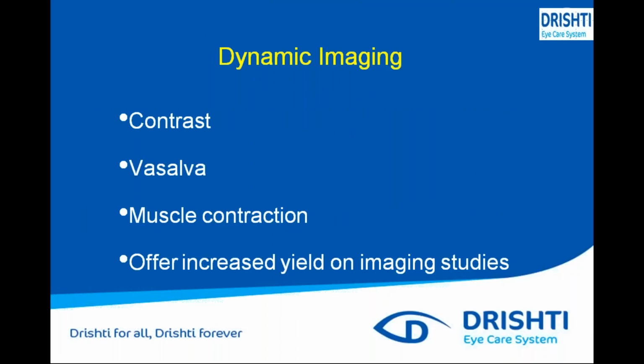Nowadays the scans have become more advanced, and this is called dynamic imaging. What advancement has come? Contrast has come. Sometimes your mass and your vitreous look the same in color. If you are not able to distinguish the exact location and exact area of your tumor, in those cases you can increase the contrast. With contrast, the bony areas and the orbital area will be enhanced, so you can easily identify the exact location of your tumor. This is done in special cases.